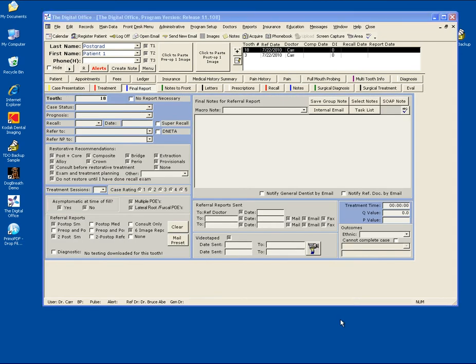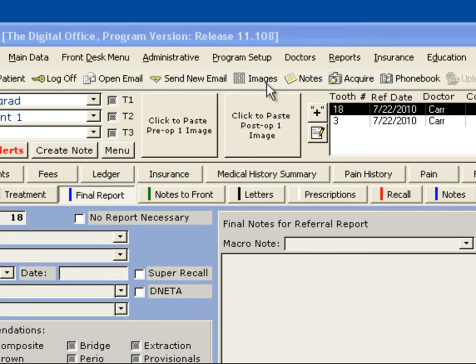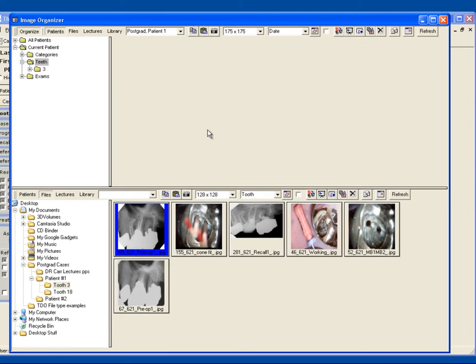The next step is to bring in images. Now you probably have your images stored on a thumb drive or some sort of removable drive. We're going to click our images button on the top toolbar, which opens up our image organizer.